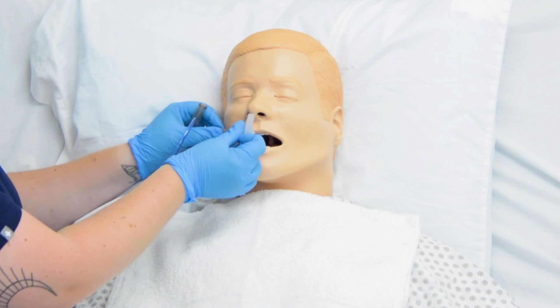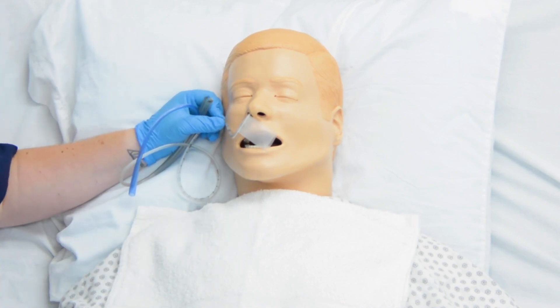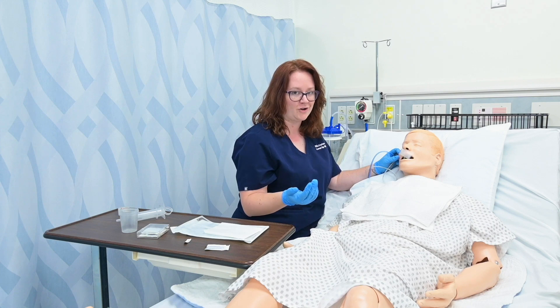I've made it to what I've estimated is the correct length, and I'm going to go ahead and secure this to their cheek. If I don't secure it, it could slip back out and then we would have to start all over again.